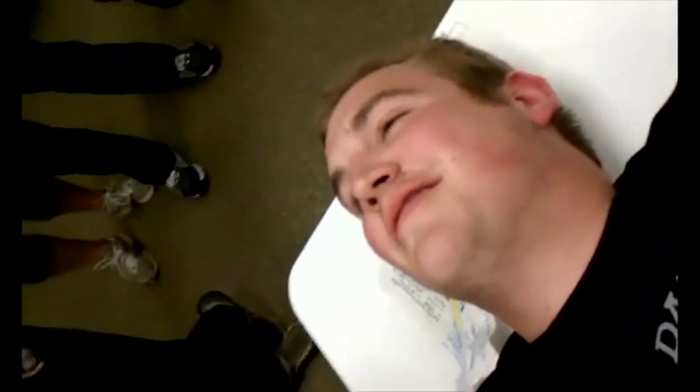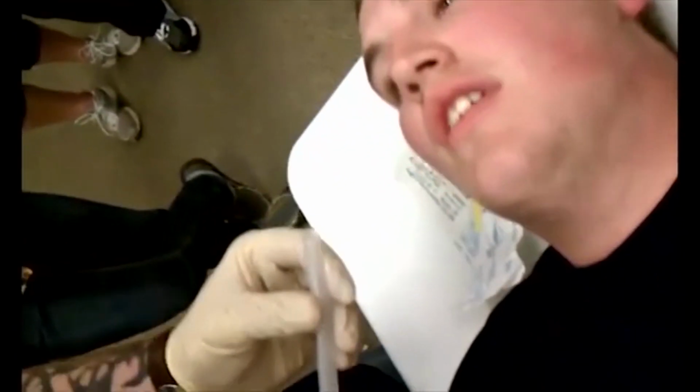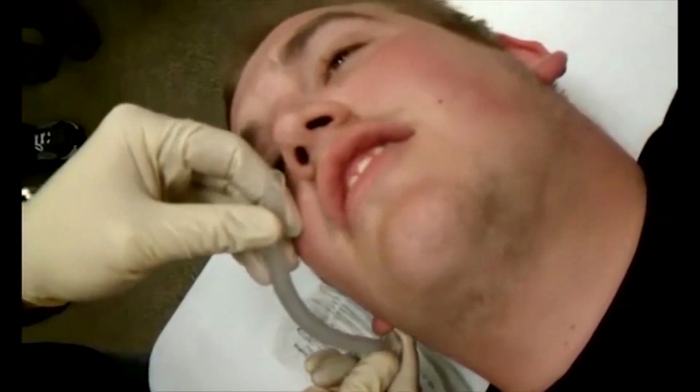Once again, this is the 2010 EMT class, nasopharyngeal airway. We're going to look up his nostrils. The right one is usually bigger because that's the one he picks all the time. All right, so go ahead, the bevel towards the septum. You show him how you measure it, from the nose to the, what did you call that? Tragus of the ear. Okay, good. So go ahead and stick it in there.